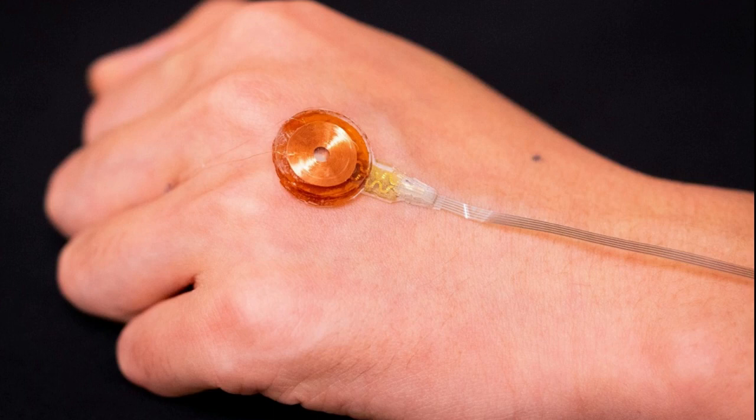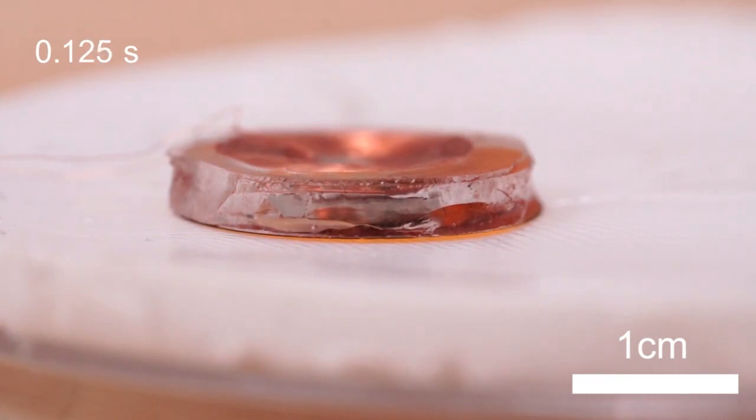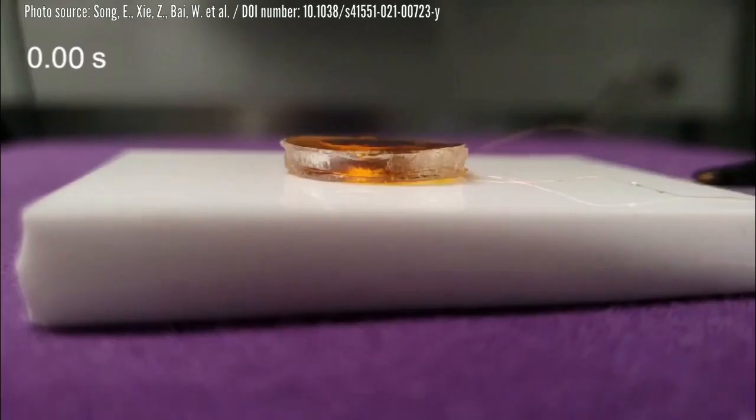The team used a miniature electromagnetic system that integrates a vibratory actuator and a soft strain sensing sheet to monitor in real time the Young's modulus, that is the tensile stiffness, of skin and other soft biological tissues at depths of approximately 1 to 8 mm, depending on the sensor designs.